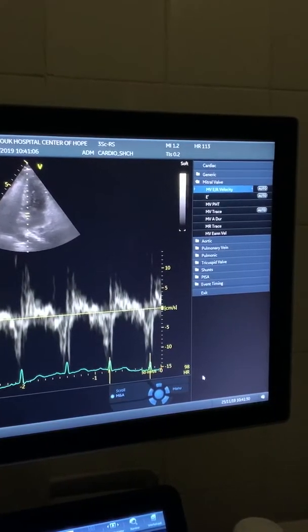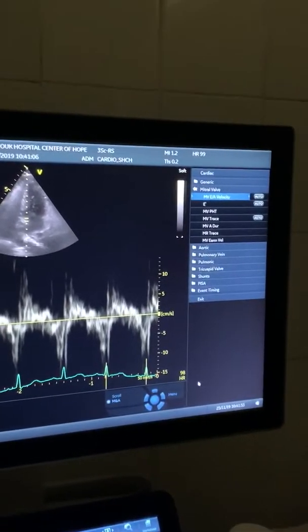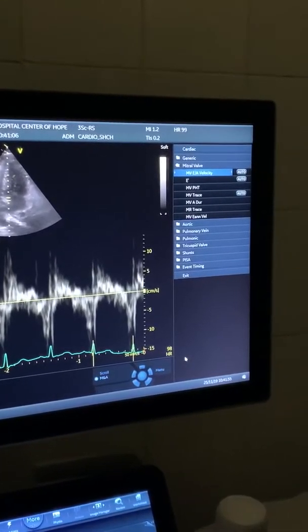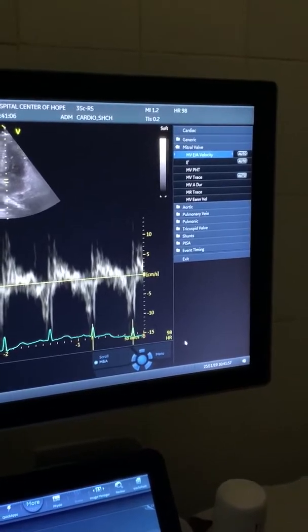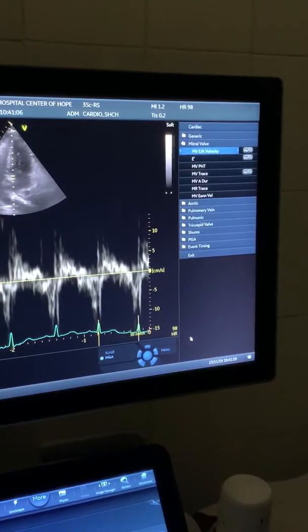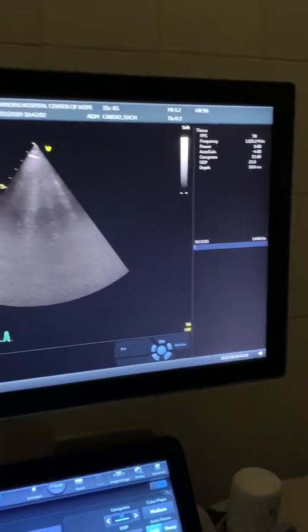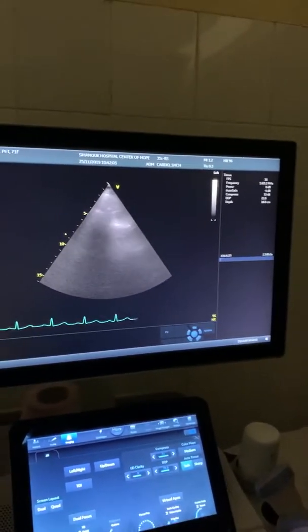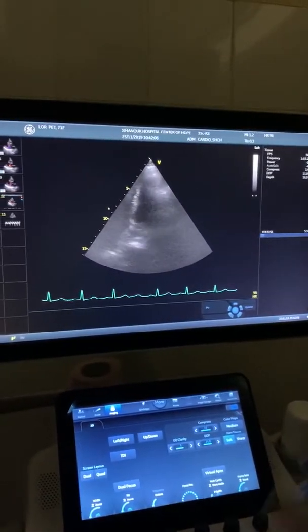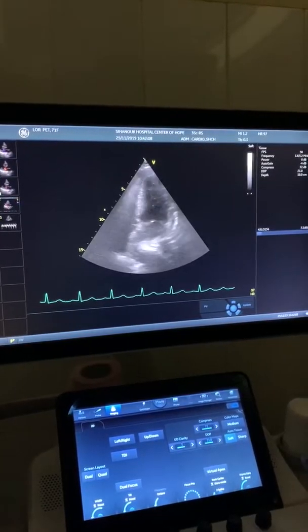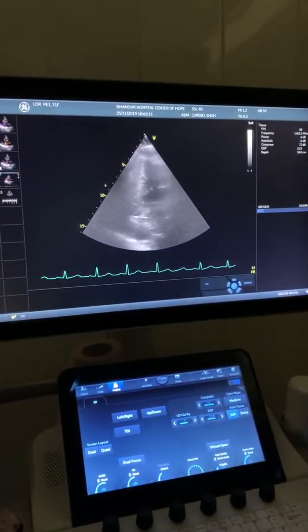Maybe we can get a better patient who's not going to be too long. Let's try - maybe finish for her now. Let's see very quick one. Mitral E/A, TDI - now let's measure LVOT.